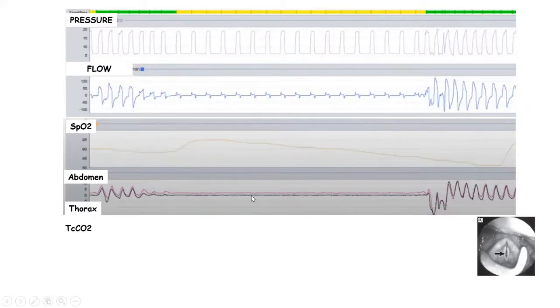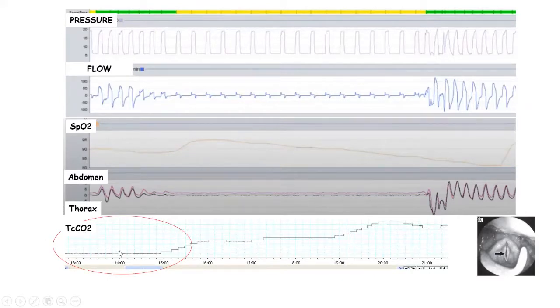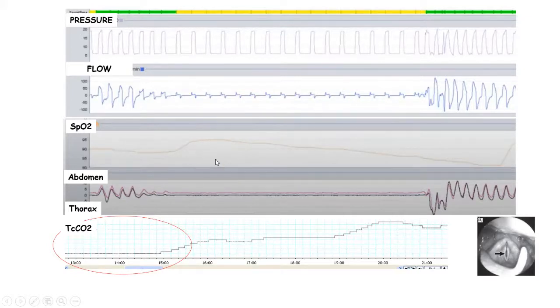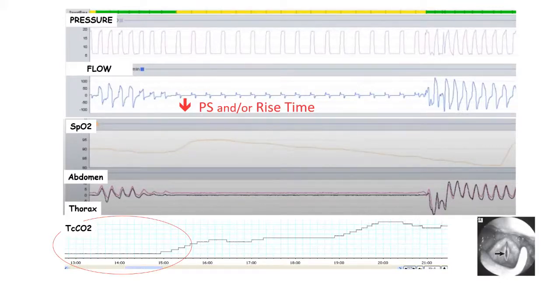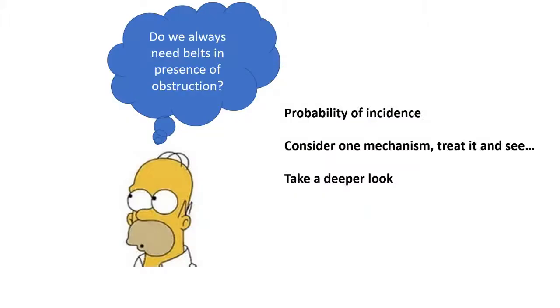In the second case — a reduction of flow followed by oxygen desaturation with no belt movement — by monitoring pCO2, I saw that just before this prolonged absence of drive the patient had a very low pCO2. This is a mechanism mediated by an important decrease of pCO2: hypocapnia causes inhibition of the drive and reflexive closure of the glottis. In this case you do not increase EPAP — on the contrary, you should decrease inspiratory flow, decrease rise time, and decrease pressure support to be less aggressive.